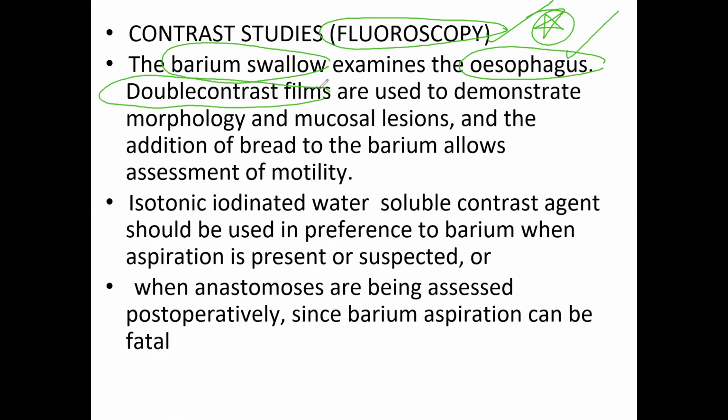Contrast is given two times to demonstrate the morphology, number one. Number two is the mucosa, and also the motility. What are the 3 M's that are assessed? Morphology, mucosa, and motility. These all should be kept in mind.